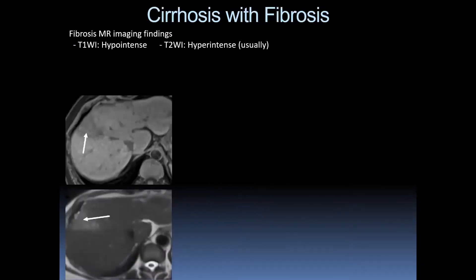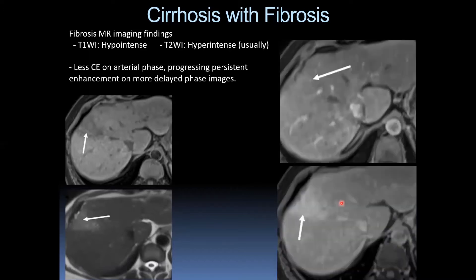Let's talk about fibrosis with cirrhosis. Typical MR findings include T1 hypointensity and T2 hyperintensity, with a diffuse or geographic appearance. We see a wedge-shaped area of T1 hypointensity and T2 hyperintensity, and on post-contrast imaging, heterogeneous enhancement in the arterial phase with progressive enhancement persisting on delayed phase. Reticular areas of post-contrast enhancement are also visible, all consistent with focal and diffuse hepatic cirrhosis with fibrosis.